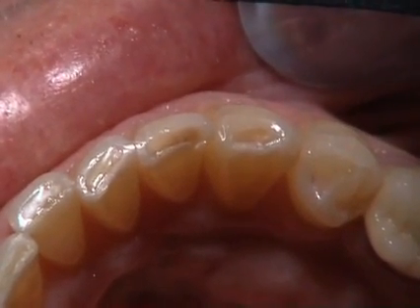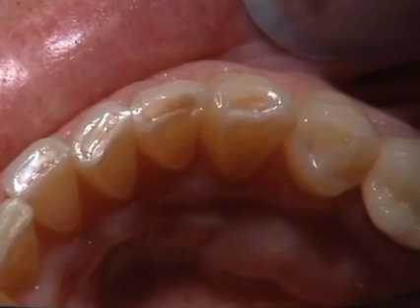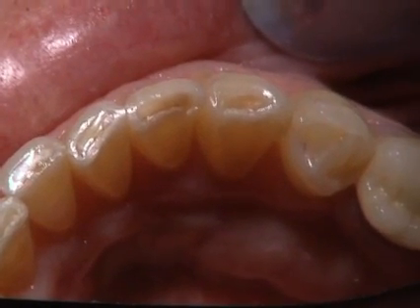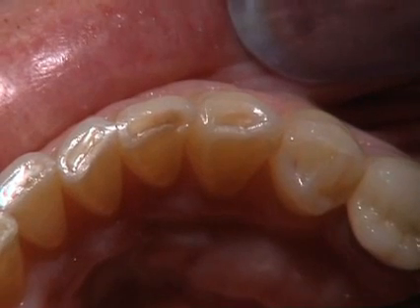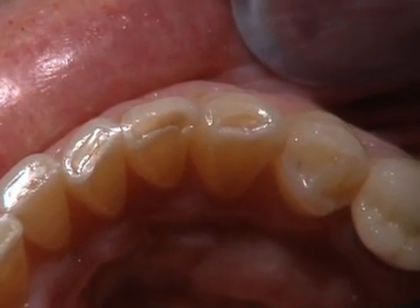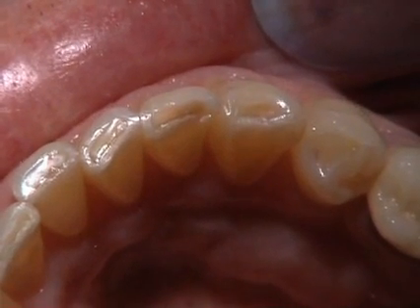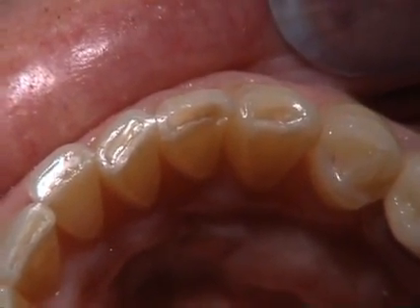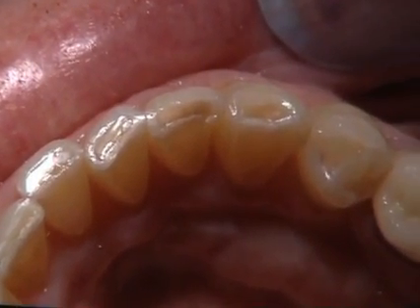That gives you more depth of color, a more natural look, and more blendability — a chameleon effect where the margins of the enamel material will blend into the existing enamel of the tooth and help hide your restorations more effectively. The depth of color comes from within versus a uniform one-shade color all the way through, because these teeth have a darker dentin shade and a lighter enamel outer surface. We're going to try to mimic that — mimic nature by building it anatomically, not just a shaded technique.